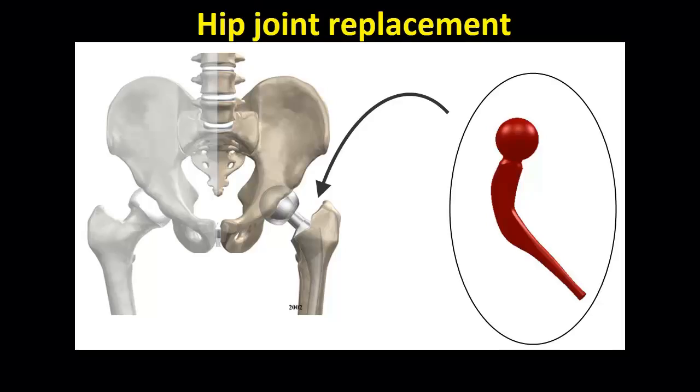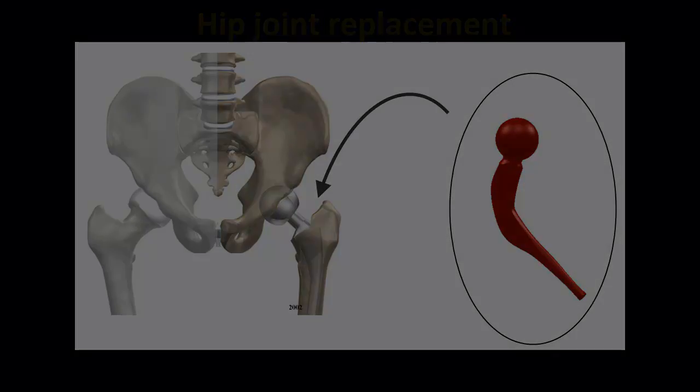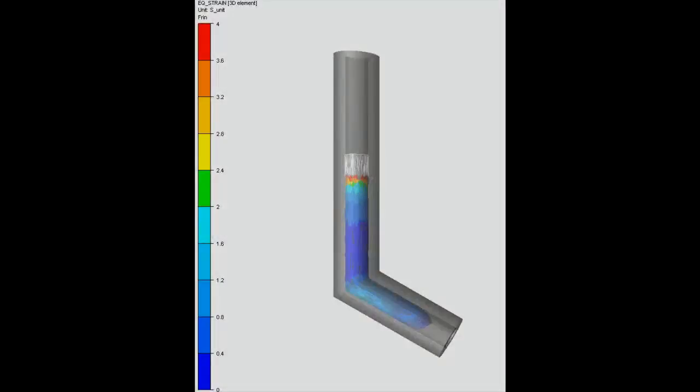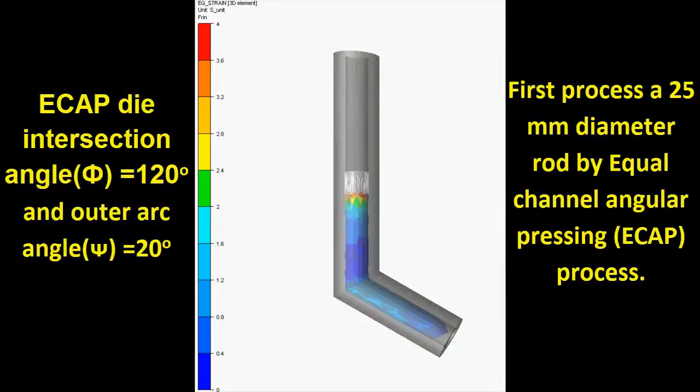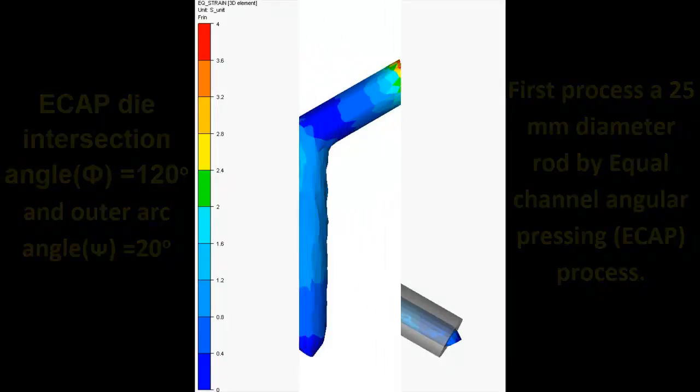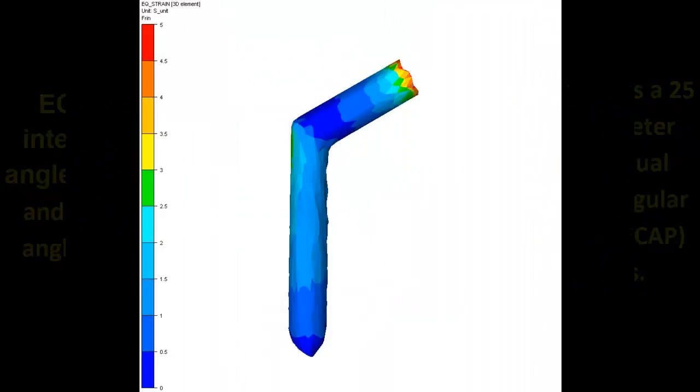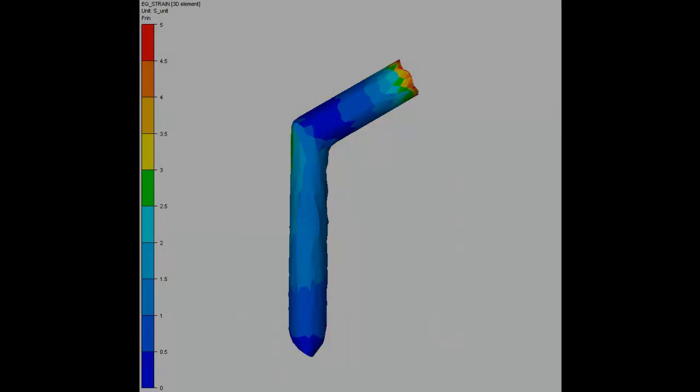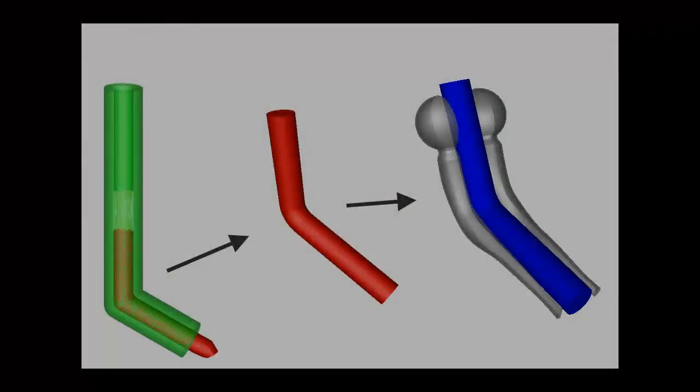Now after processing, the specimen is placed between specially built hip bone shape dies. These dies are hydraulic power operated and transform the ECAP specimen into the desirable artificial hip bone shape.